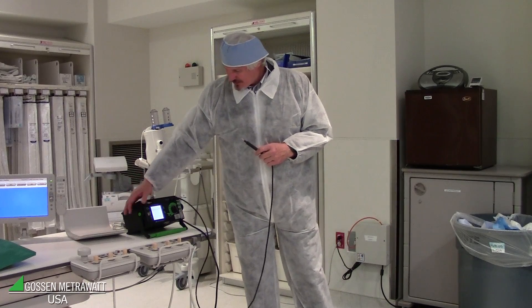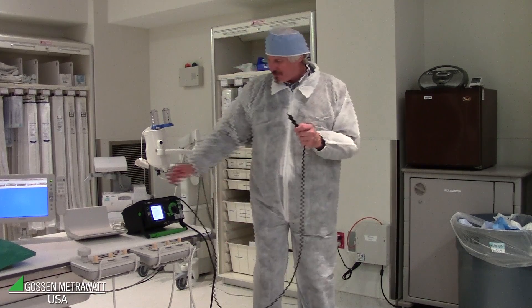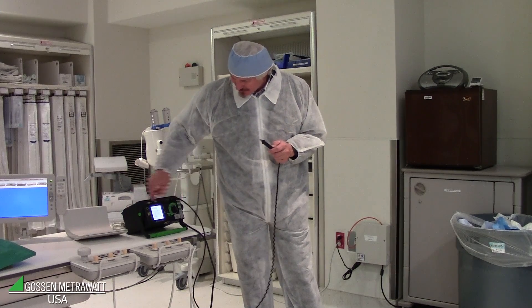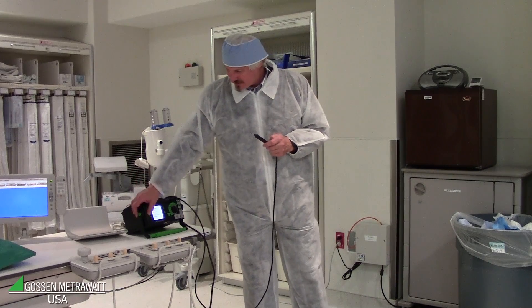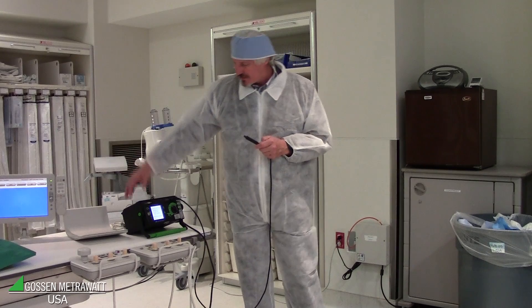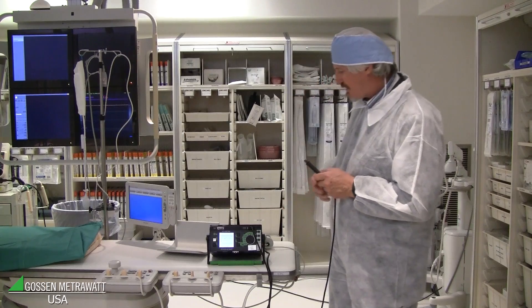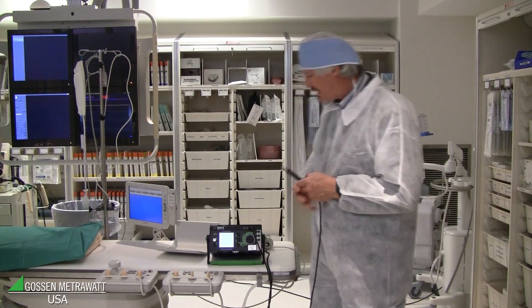We connect the power supply and the probe, and start the touch current measurement. The device is fixed installed, and mains is already switched on. The device is already booted so we can start.